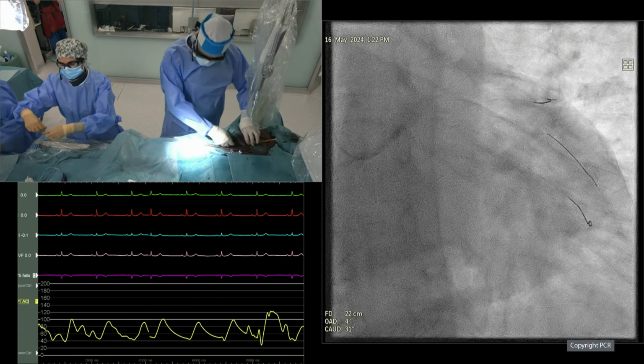Well, I think it depends a lot on the vessel, no? But this is left main, and this is the LAD. So keeping access to it looks like a good option, I think, for the future of the patient. You could have good access with a good POT, and I guess that's the opposite view, but let's see. So the bended wire now nearest is circumflex. Okay. So yeah, so we're gonna.